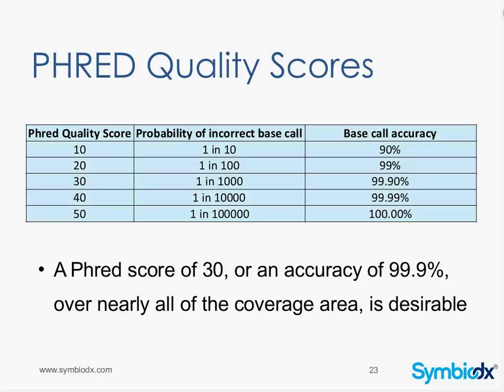While this is not an illogical way to look at it, it also diminishes the importance of these Phred scores in next generation sequencing, because we're looking at so many different data points, because we are looking at 68 genes, a significantly higher number of exons, and a significantly higher number of amplicons. The more points you look at, the higher your accuracy rate needs to be.